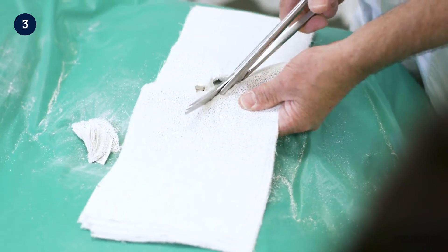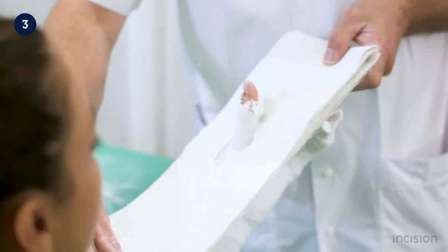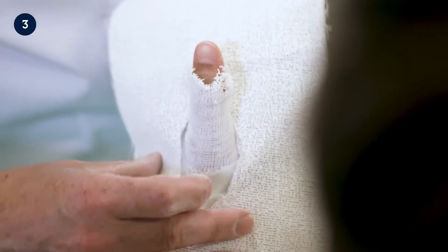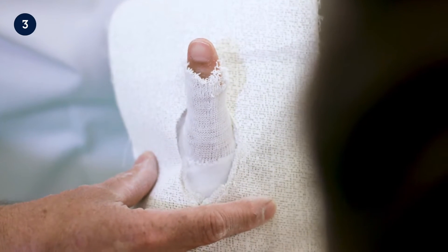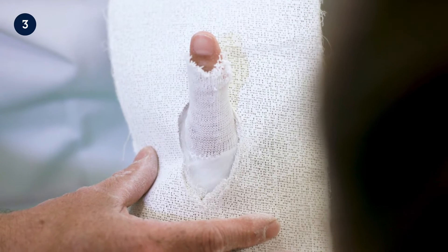The final size of the hole is checked on the patient's thumb. The hole should be wide enough so that the base of the first metacarpal bone is not covered, avoiding pressure complications. This also avoids too much pressure on the superficial branch of the radial nerve, which may cause tingling in the thumb.